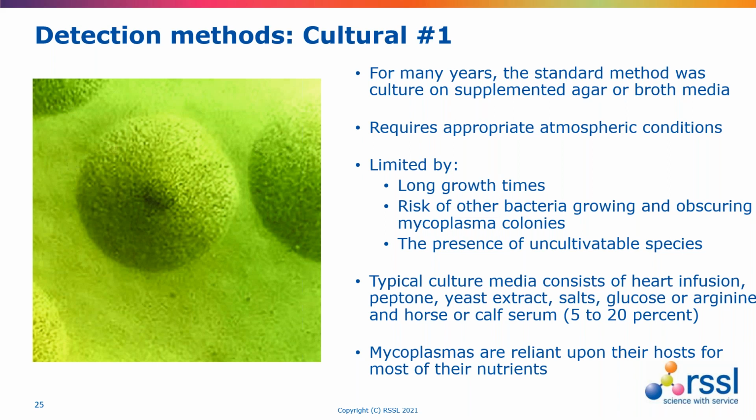And the big limitation around the culture-based approach is the long growth times required, and we spoke earlier about the slow rate of growth of mycoplasmas. And with any culture-based microbial test, we're also faced with the dilemma around uncultivable species, which could be natural or acquired. It also stands that the culture media used for mycoplasmas needs to be specialized, and it's what's referred to as a complex culture media.